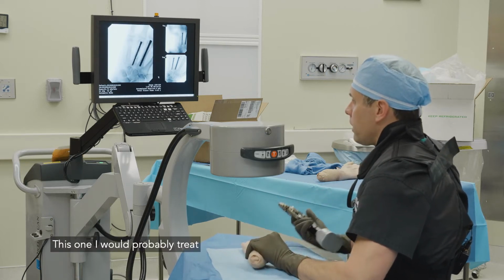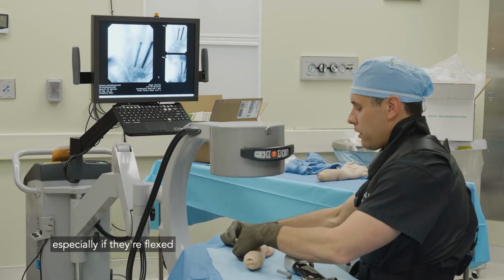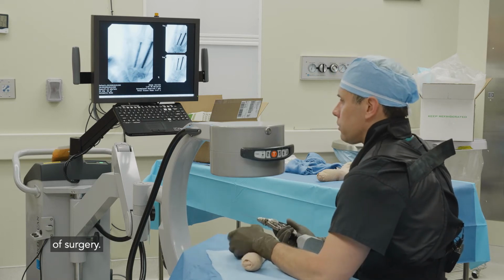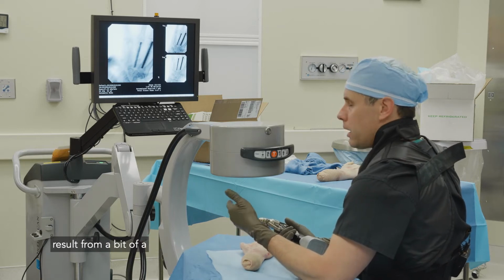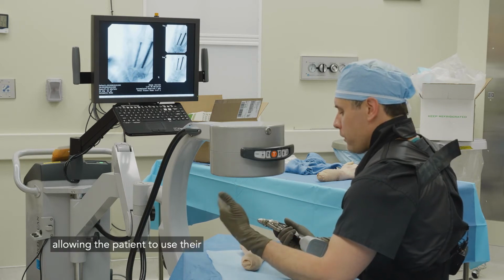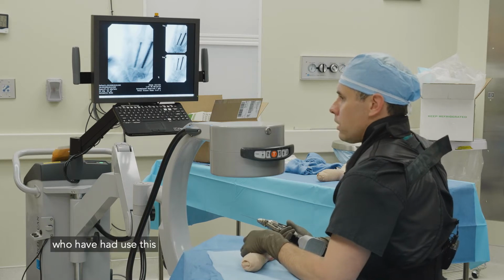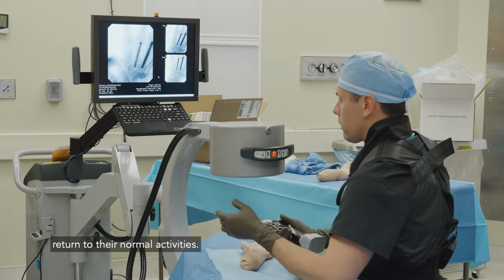This one I would probably treat non-operatively, but when they come in more displaced, especially if they're flexed down more than about 40 degrees, I have a long discussion with the patient regarding the pros and cons of surgery. A lot of patients do not want the bump that's going to result from a bit of a flexed union there. Other times, simply allowing the patient to use their hand quicker is very attractive to them. I've got athletes, MMA fighters, who have used this technique and have been able to return to sports much quicker, to return to their normal activities.